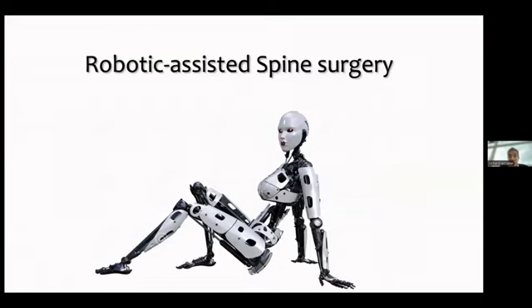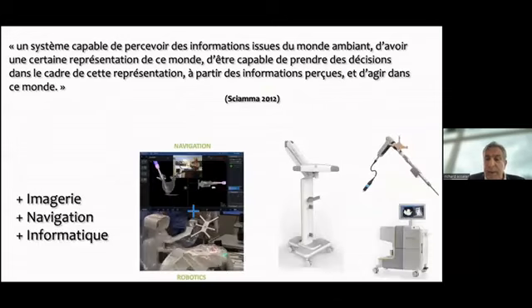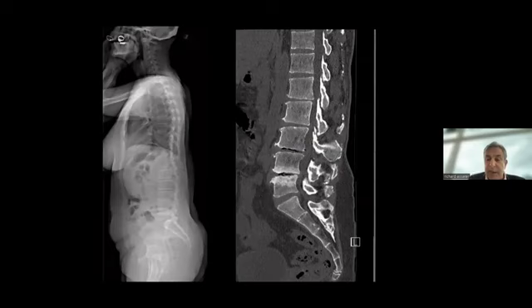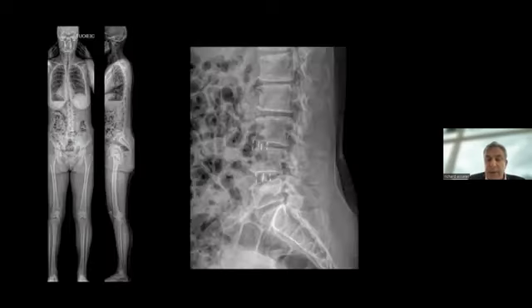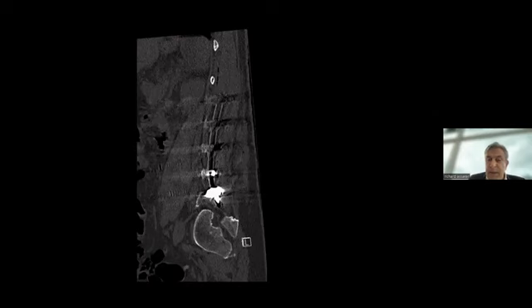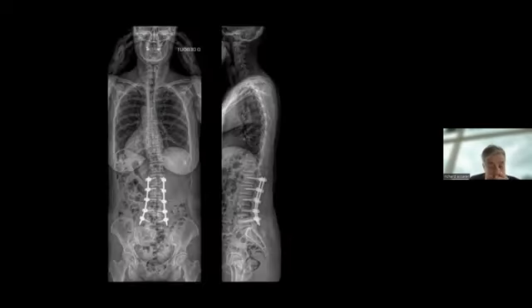Recently I want to share my latest acquisition in this technology: robotics. Surgeons everywhere are now planning and simulating surgery before executing it. We acquired the Mazor robot, and here is the surgical planning. This patient had two-level ALIF and robotically assisted percutaneous screw placement. The screws are placed with robotic assistance, and here is the postoperative result.